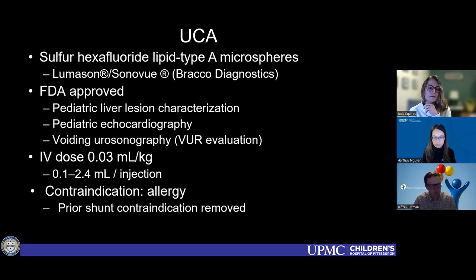One other thing that sometimes is a little bit confusing: there used to be on the package insert a contraindication to use of some of these agents in the setting of cardiac shunts. I think some people maybe interpret that as it might change the enhancement characteristics, but it was a theoretical safety concern, and that contraindication is no longer present. So patients with congenital heart disease, infants with patent ductus arteriosus, whatever, it's okay to give that stuff. The only contraindication in this day and age is allergy.